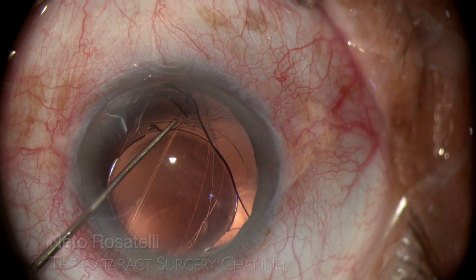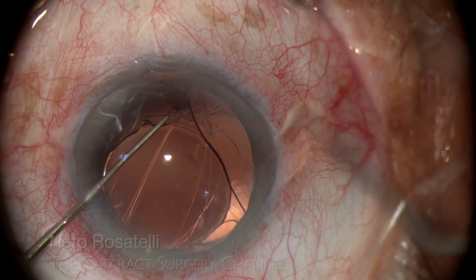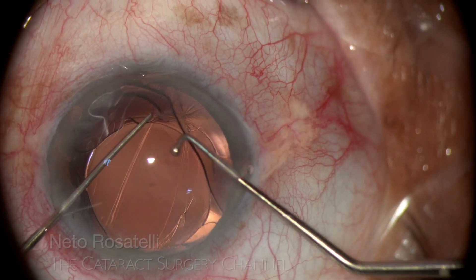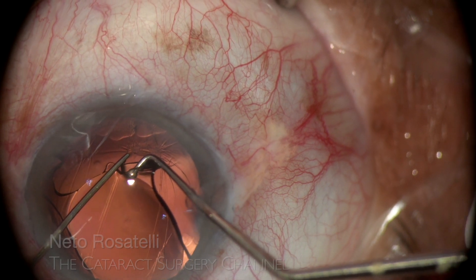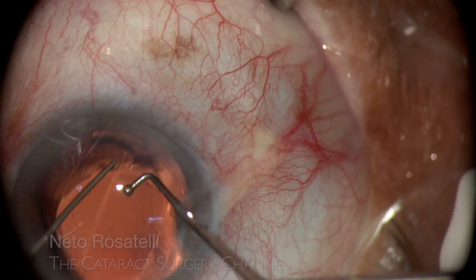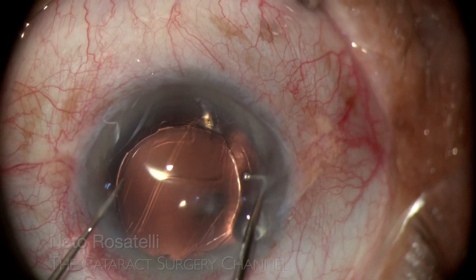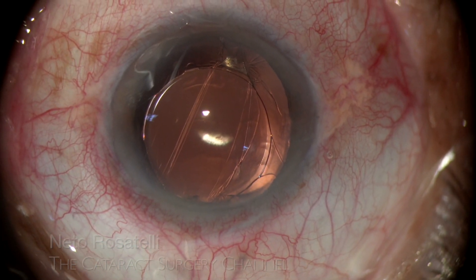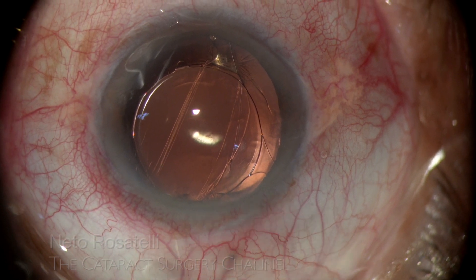I rotate the IOL to position the remaining posterior prolapsed haptic in one of the aperture ends at 12 o'clock, and proceed to prolapse and capture the opposing haptic. While holding the IOL with the lester hook, I use a short chopper to nudge the intended haptic downward into capture and succeed.